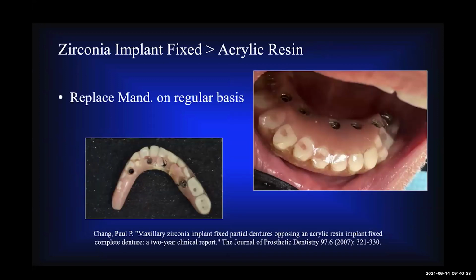We like systematic reviews and meta-analyses. So what's the problem with using acrylic resin? Well, number one, it wears out. And the article basically says that you need to replace it approximately every 5 years. I don't know many people who want to practice where they're continuously replacing these every 5 years. The patient's not going to be happy about that, and I just don't think that is a good practice. My experience is this right here: I usually see fractures. I see excessive wear of the antagonistic arch. So you have to be very, very careful doing that.